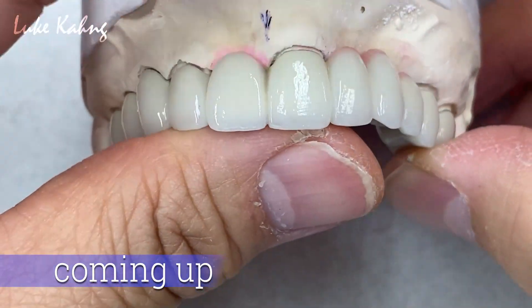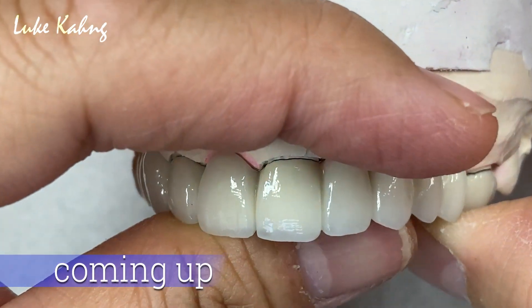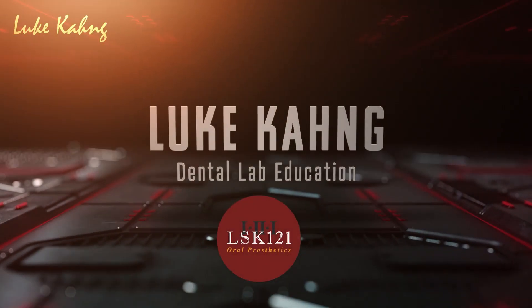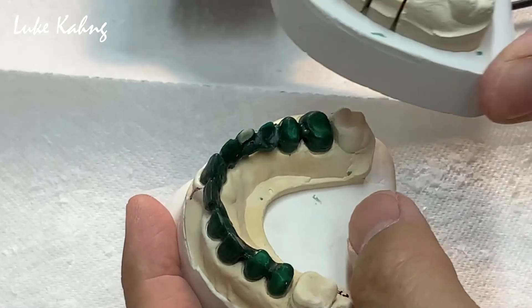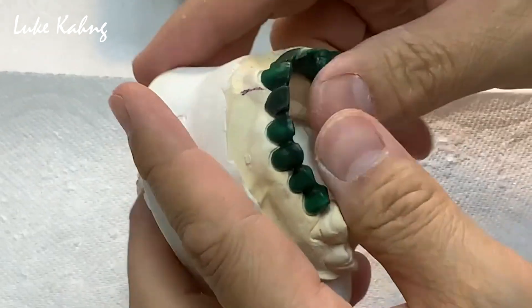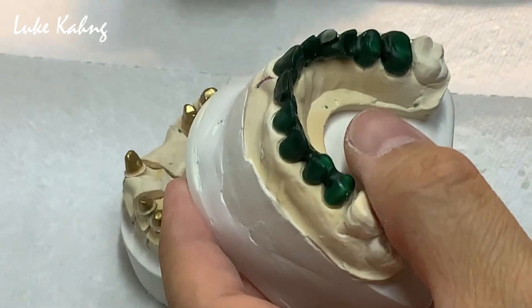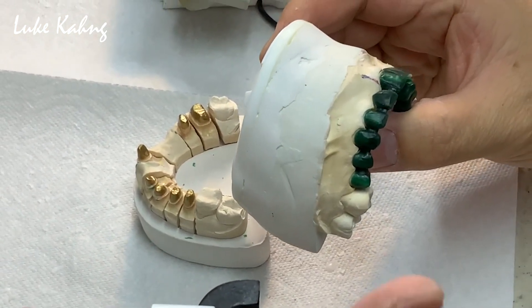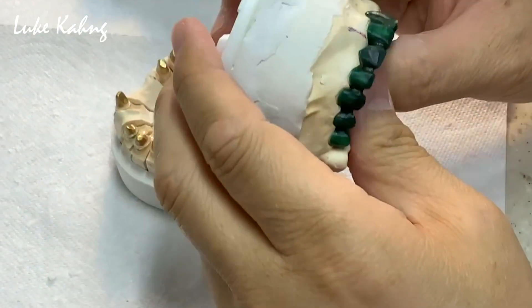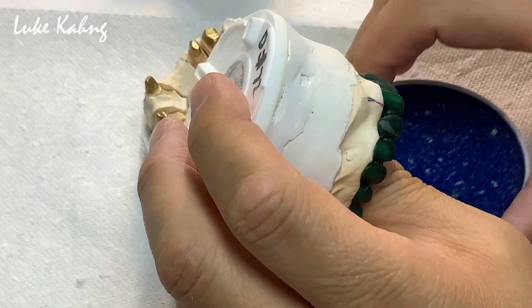That's good alignment and this is the finals with a good amount of translucency. So the 11-unit case is pretty complicated, so I would like to share with you guys what I do here.